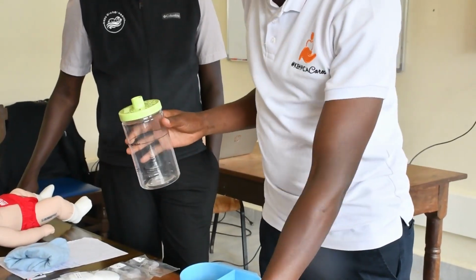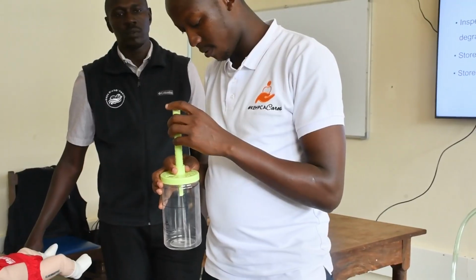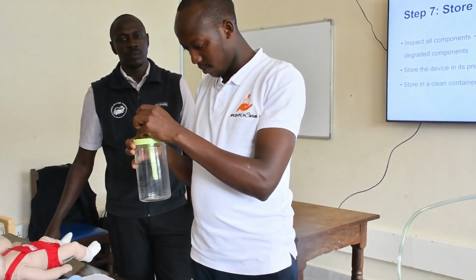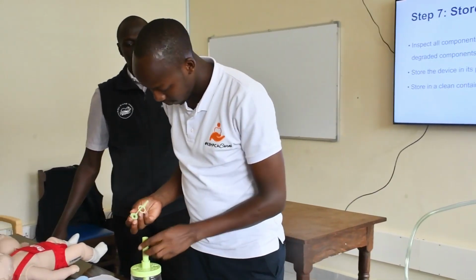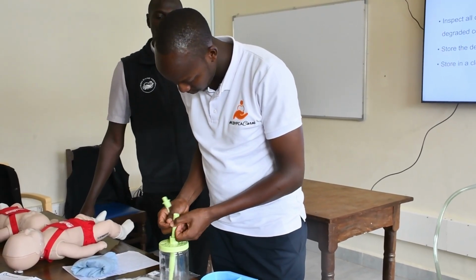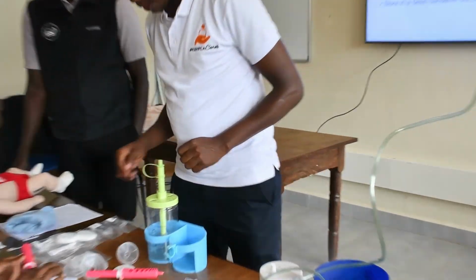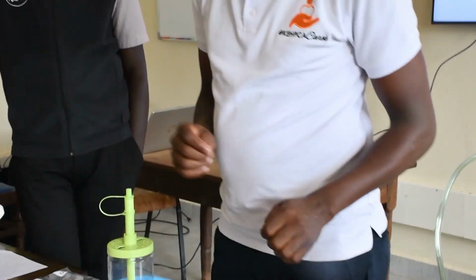The pressure generator, we assemble first. And in place we should be. Okay, here is the pressure generator holder.